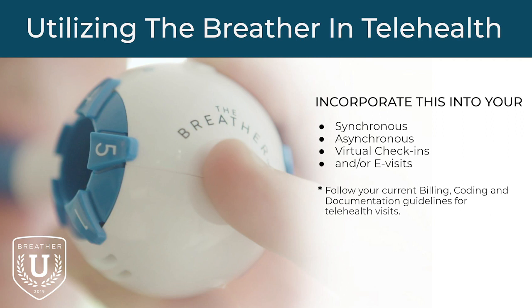You may want our training journal, which I'm going to show you how to access later so that you can send all of that over to them early on. I love to send out also our cleaning handout so they understand how to clean that breather, keep it dry, and really use those sanitary precautions. So I like to send that out with the handouts. You may have homework for them. However you're doing that currently, through email, sending that over, you want to send over everything about the breather too. Let's go now and look in on one of our videos.